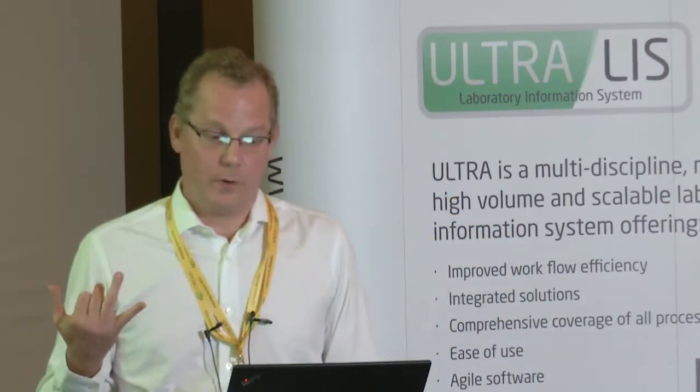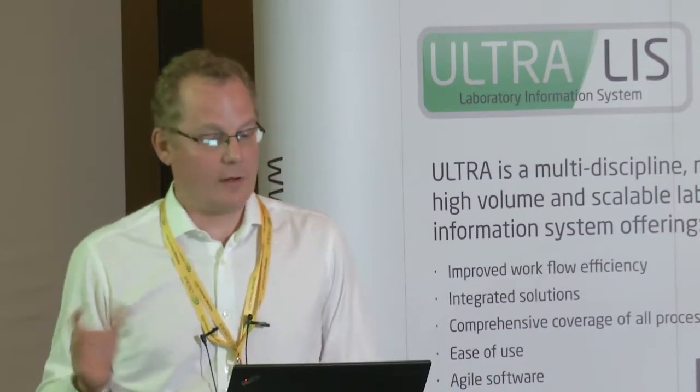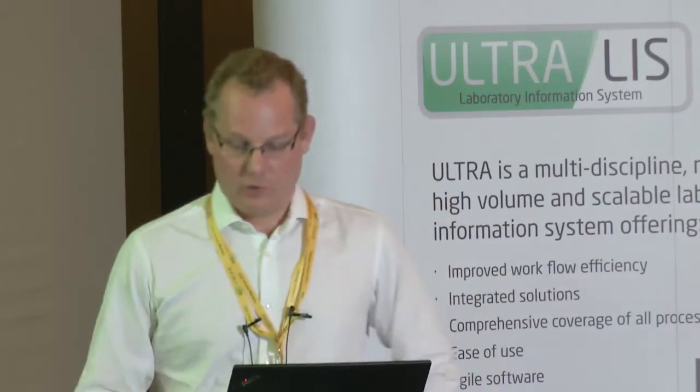Of interest, I think, two cases of oral candidiasis were missed on the original glass report, but picked up on the digital scan. And in fact, the ground truth for these errors lay equally between glass and digital. So we conclude that there is absolutely no reason why you can't use digital pathology for your routine diagnostic work.